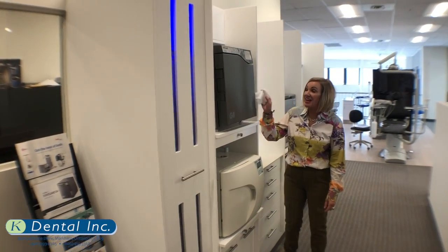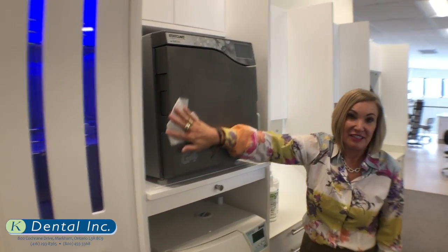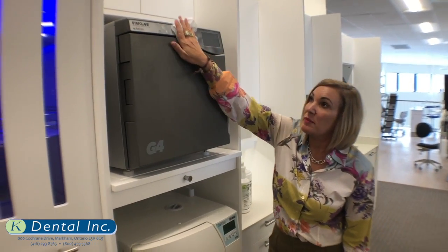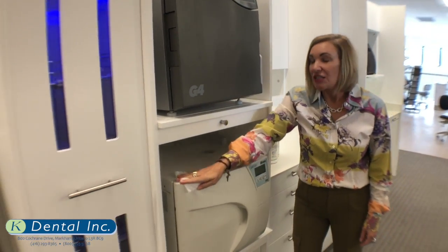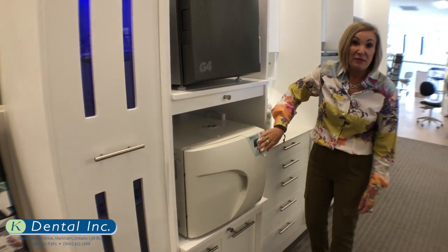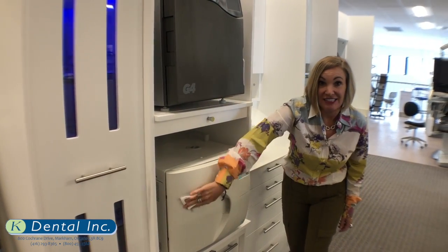Another benefit of Optum is the efficiency of it. You're using one wipe in order to disinfect and to clean your surfaces. So you're going to be using half the amount of wipes than other disinfectants out there.